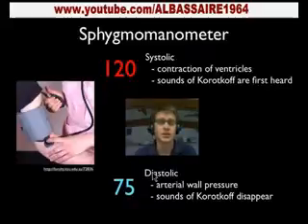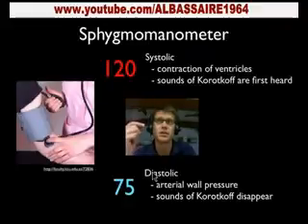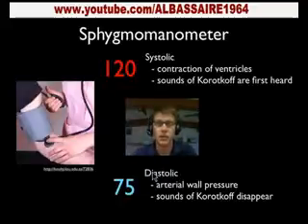Now, how does it sound? Well, we have what are called the sounds of Korotkoff. Essentially, you listen at the artery, and then you increase the pressure, and then eventually you decrease the pressure. Let's say we crank it up to around 150, and then as you slowly let go of the pressure, this is what you'll hear. You don't hear anything, and then all of a sudden you'll hear the sound, and that's the sound of the ventricles of the heart pushing that blood through. We've lessened the pressure so the blood can now get through.